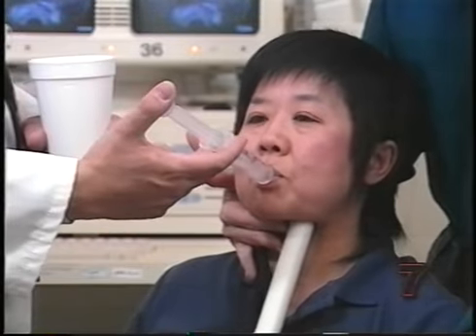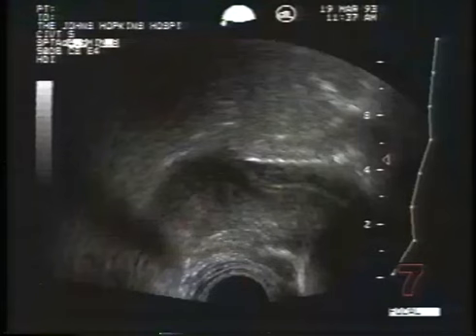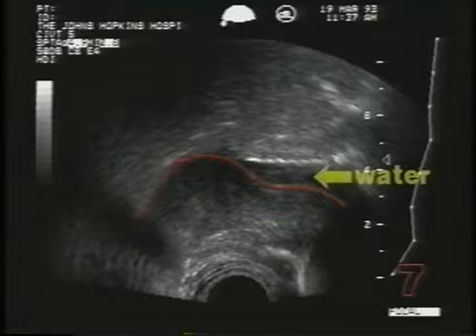Another major application of ultrasound is to swallowing. We first see the water enter the image, and we see the tongue deform around the water bolus. Typically, if it's a command swallow, the subject will hold the water in their mouth for a moment and then begin to swallow.